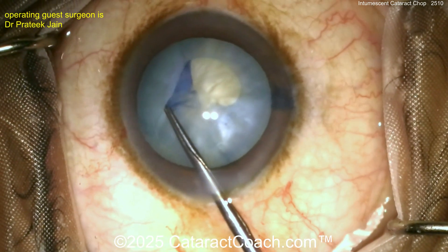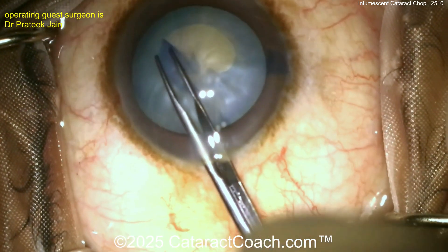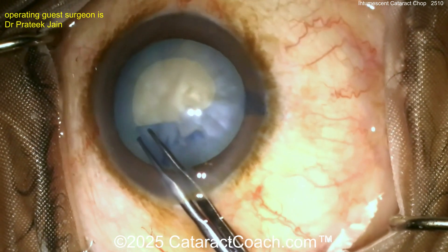Starting off with the grabbing with the forceps, getting that rhexis done — very nicely done. A nice round rhexis. I like the technique, and we'll complete that.